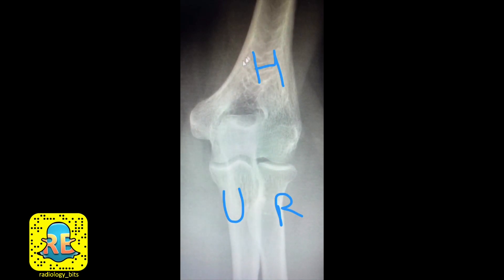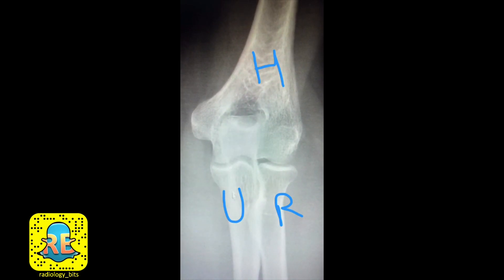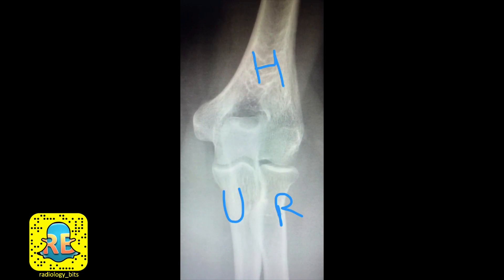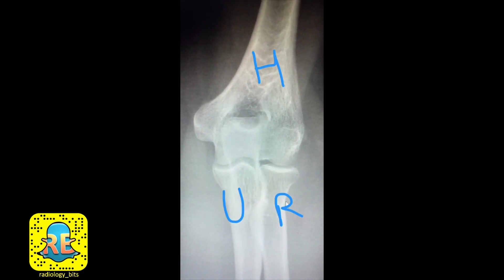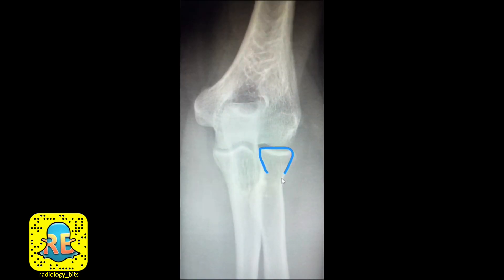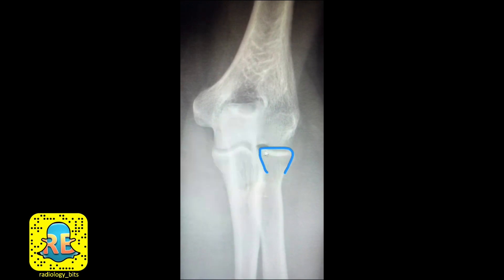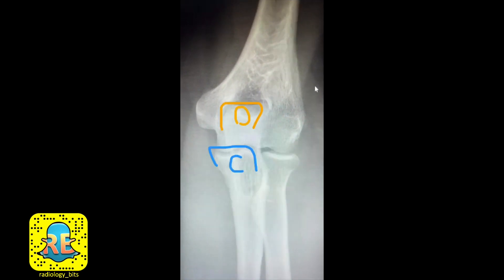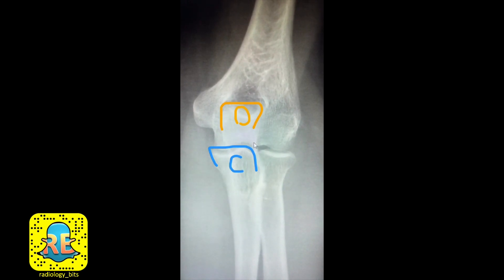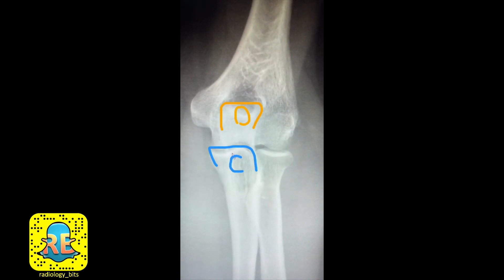You're looking here at the humerus. This is the radius and this is the ulna. The radial bone in an anatomical position is lateral while the ulna is medial. Starting with the easiest bone, this is the radius with the radial head here. The proximal anatomy of the ulna is easier to see on the lateral radiograph, but let's finish here then correlate with the lateral.